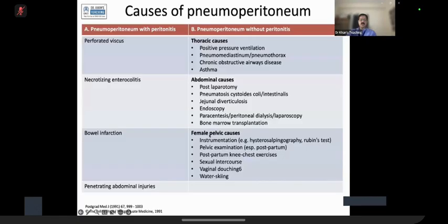Look at these conditions. HSG, remember that, which is common sense. Look at the female anatomy: vagina, cervix, endometrial cavity, then the fallopian tube. So anything which comes from below, from distally, through the fallopian tube, will go into the peritoneal cavity.